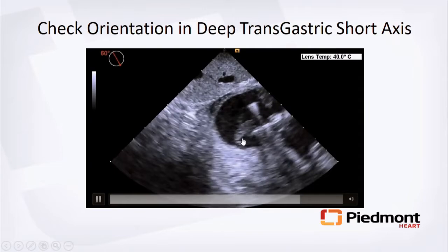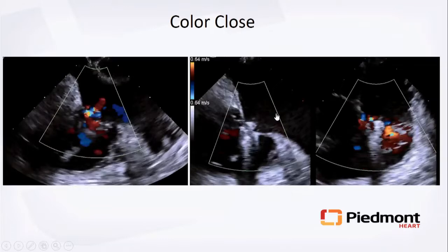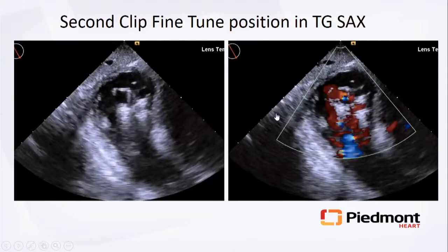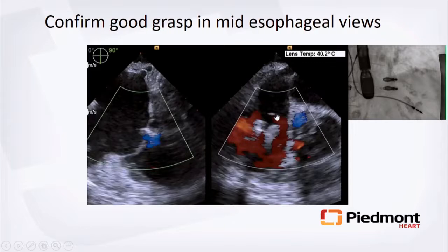Switch to transgastric short axis to confirm position: antero-septal commissure, septal leaflet, and anterior leaflet are identified. Once happy, open the clip arms to grasp the leaflets, go back to mid-esophageal view, drop the grippers, then close. Always check the gradient and consider a second clip if there is residual tricuspid regurgitation. The final result after two XTW clips in the tricuspid valve is shown.